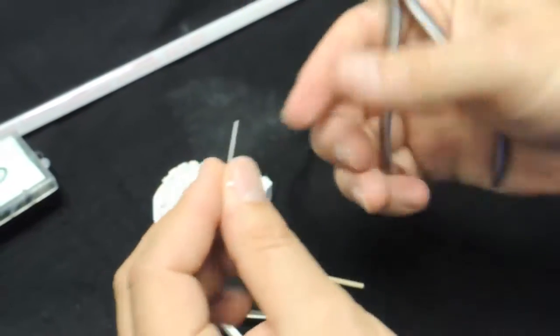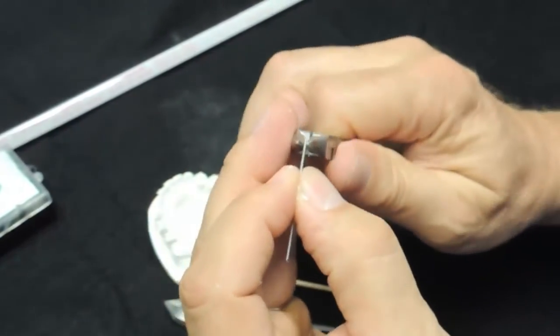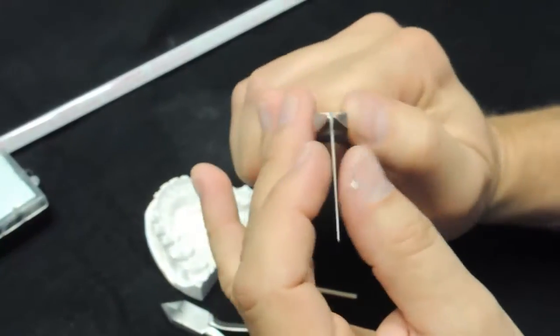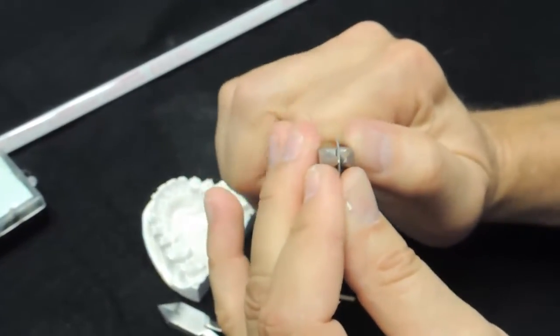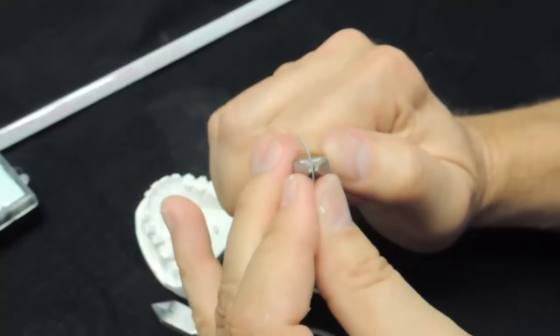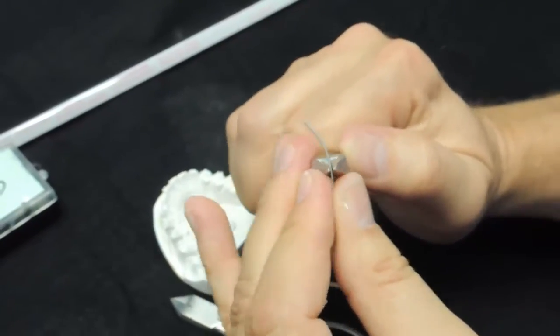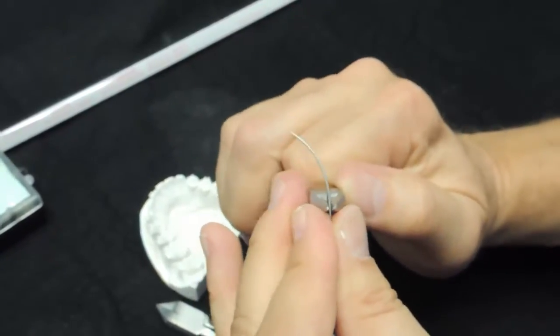The first step in bending the wire is to make the arch form, and I do that just with a bird beak. You can do that with whatever you want to use, you can use a hollow chop plier. I like to just get the arch shape with a bird beak like this.